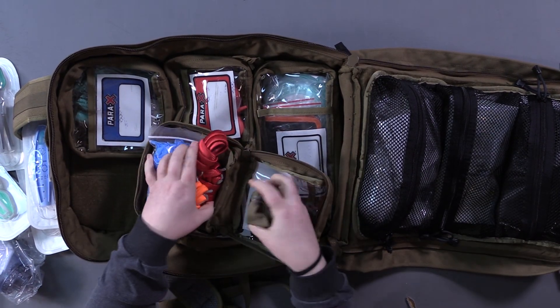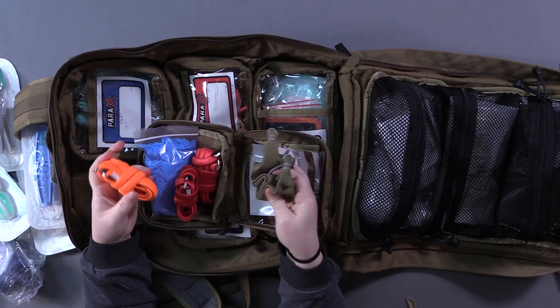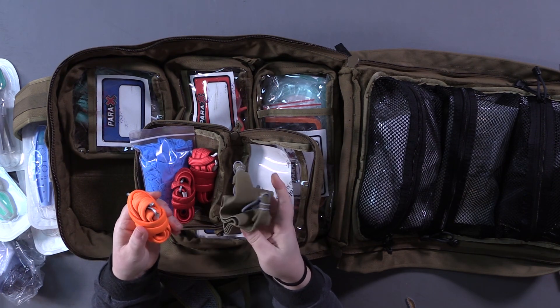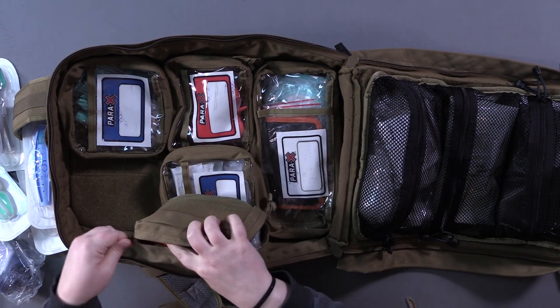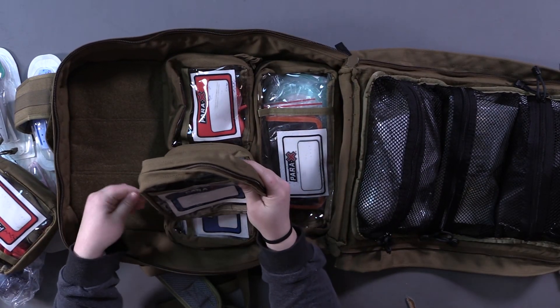In the bleeding kit we've got gloves and multiple tourniquets. Notice we don't have windlass-style tourniquets in here — that's because they will bottom out on small children, and since this is a designated peds bag we want stuff that fits them. We have the TK4 and a couple of RATS tourniquets. They will all work on adults as well, but not all windlass-style will work on kids, so we went with the elastic-style tourniquets.